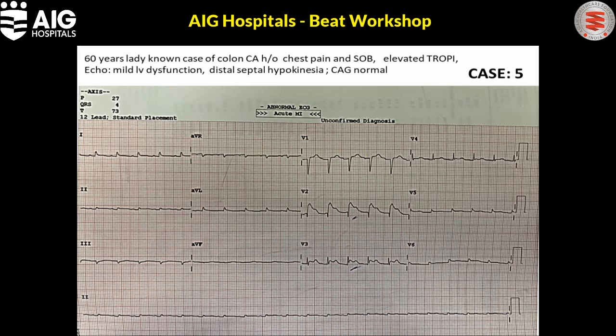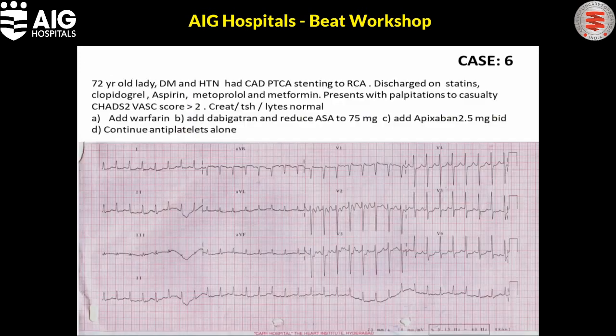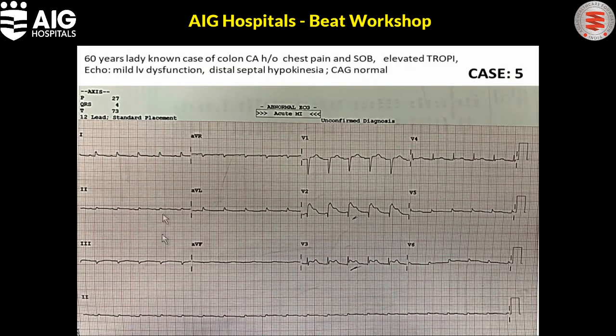So in the presence of normal coronary arteries, when you have mid precordial ST elevation with sparing of V1, that is, the basal septum is spared, and the QT is upper limit of normal, you should suspect that this is very typical of a Takotsubo cardiomyopathy, a stress cardiomyopathy. On going through the history, this patient recently lost her husband a week prior, and following that this has happened.